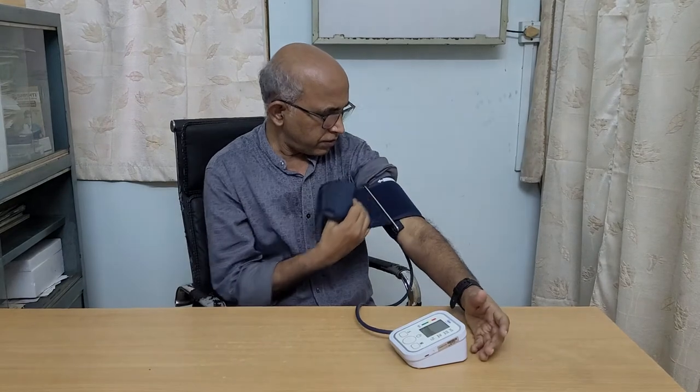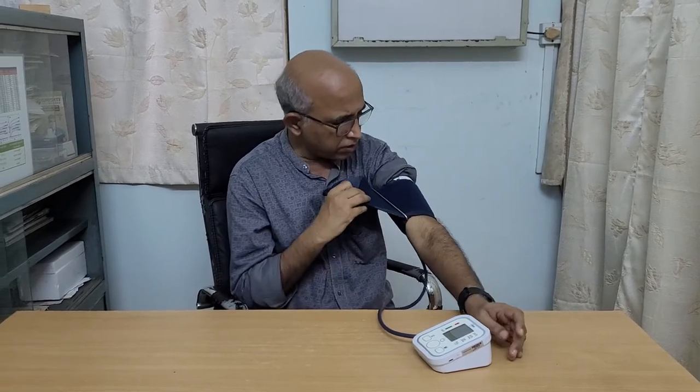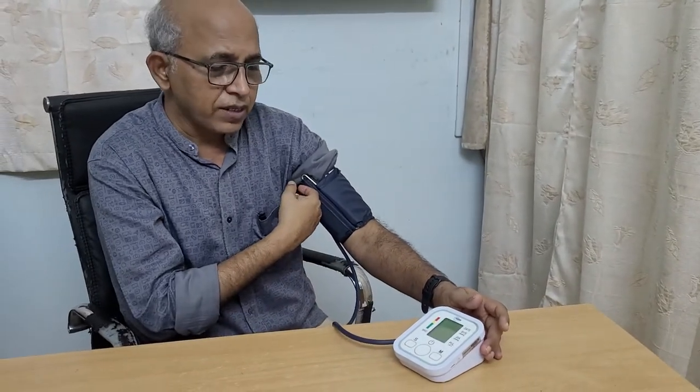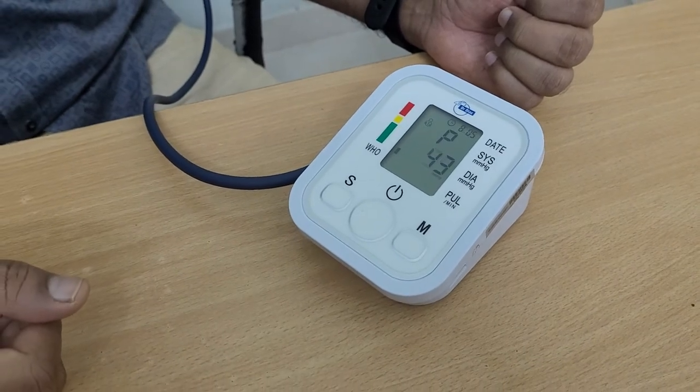This is a digital BP monitor. All the other precautions are the same — we have to tie this cuff about two inches above the elbow, in the middle, and the one-finger introduction test. Everything is done. This digital monitor doesn't require a stethoscope. We just have to press the start button here; it starts pushing air inside and will give us a reading. We just have to see the screen.